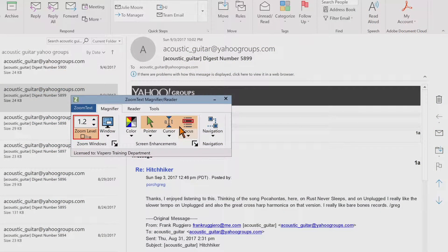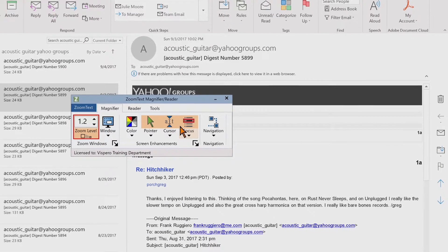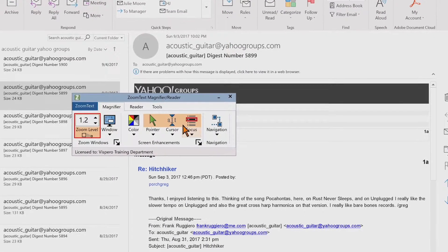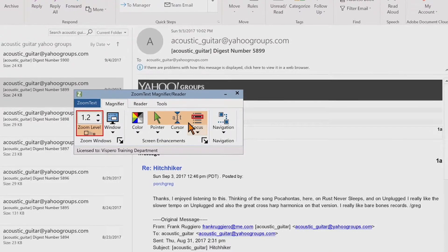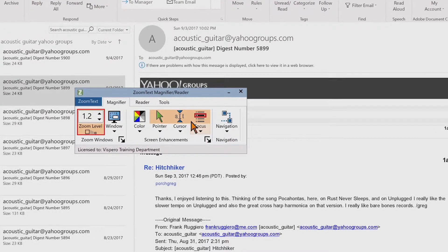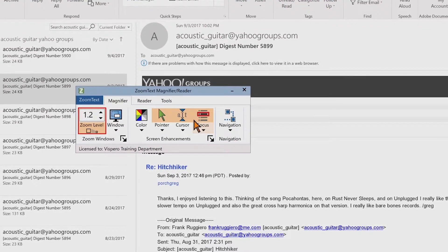The ZoomText toolbar. When you start ZoomText, the ZoomText toolbar appears on the screen. The ZoomText toolbar contains all the controls for operating ZoomText, neatly organized in the ZoomText menu and several toolbar tabs.